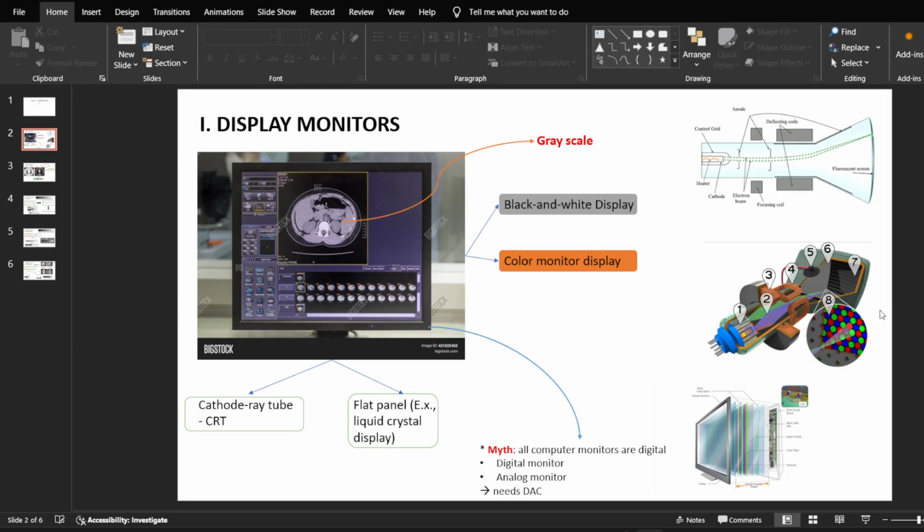When I was joining a tender, just an MRI tender, usually, my friend, the display monitor size of ours doesn't fit the requirement from the hospital. What does it mean? It means that they want a larger display monitor, but the standard configuration of our machine doesn't fit it.